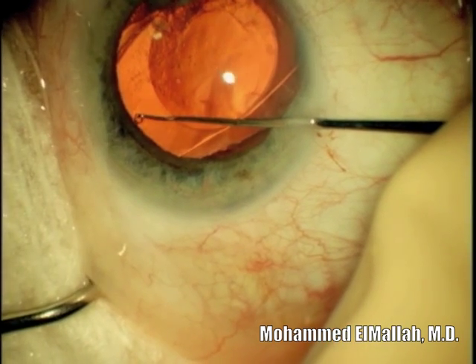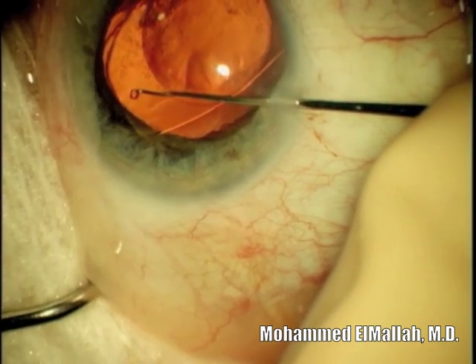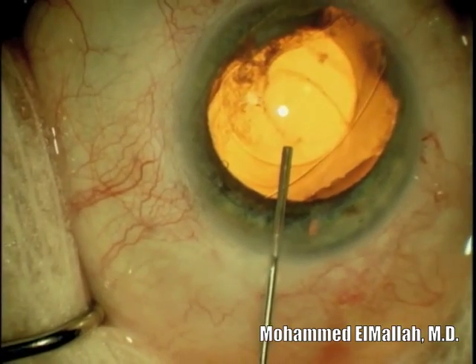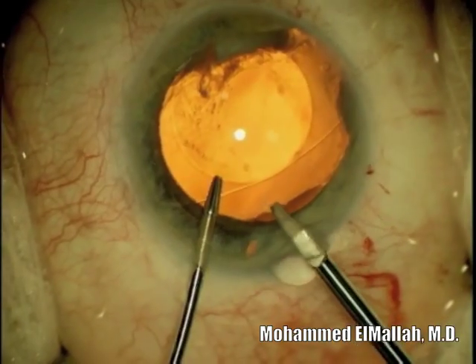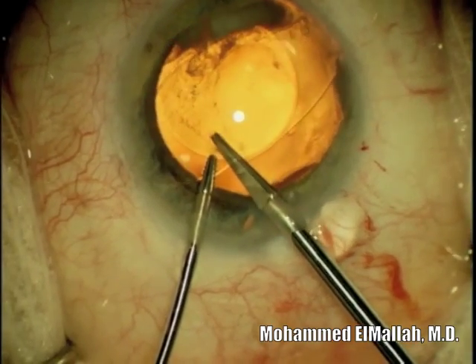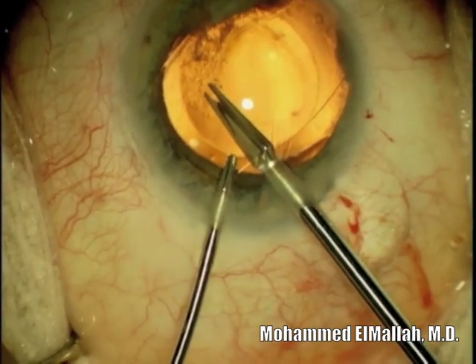Extra care must be taken as the posterior capsule is open. Here we are prolapsing the superior haptic out of the capsular bag and into the anterior chamber. The main incision is created with a 3.2 millimeter diamond blade. MST microinstruments and a lens cutter are used to trisect the lens.